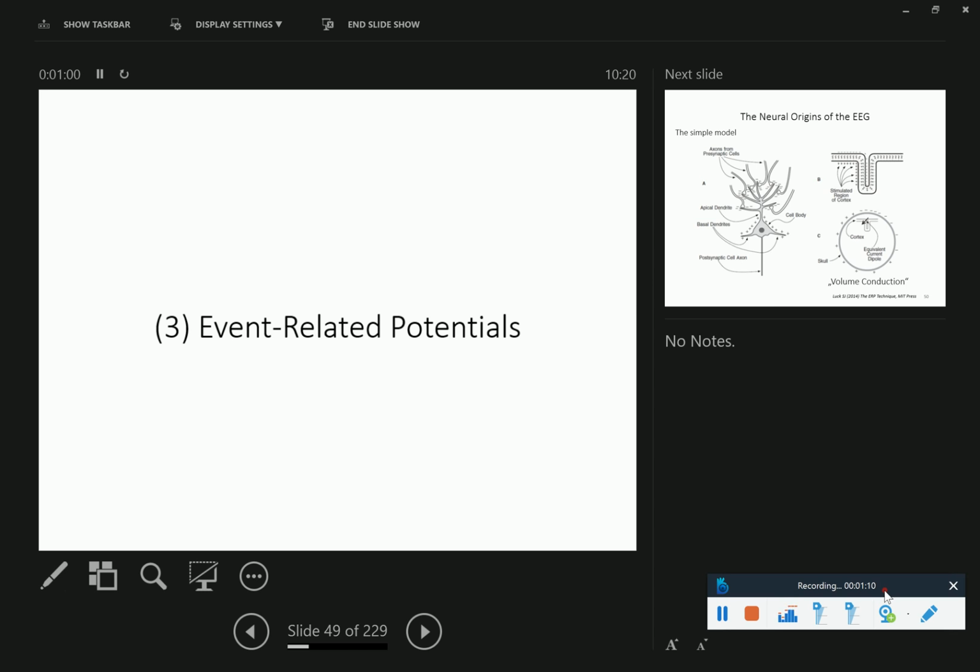Some of it's not established, which is actually a little bit weird. It should become established. That would be nicer, because you basically have the same phenomena that we are discussing now for EEG, where you give a stimulus to the participant and then record a brain response and then average over many representations of the stimulus. You can do exactly the same thing with fMRI.